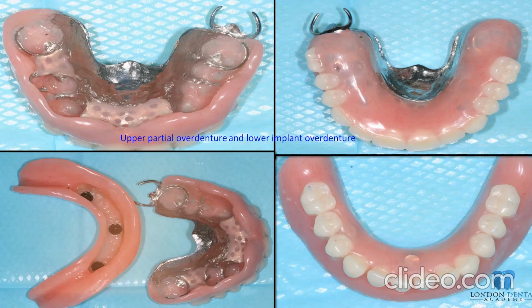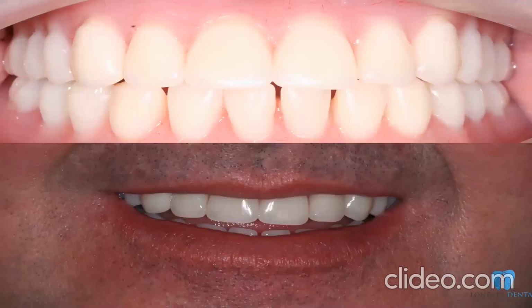would give you better stability. On the upper arch, I might change my views a little bit. The teeth might not be the greatest, but probably a couple of implants would give you an implant bridge that would enhance. But again, remember, these cases have been done almost 30 years ago. Things changed and moved significantly in the last 10, 15 years. And this is the denture. As you can see, shallow guidance on the upper anterior teeth, nice engagement of the teeth in the posterior, nice contacts, no problem whatsoever.